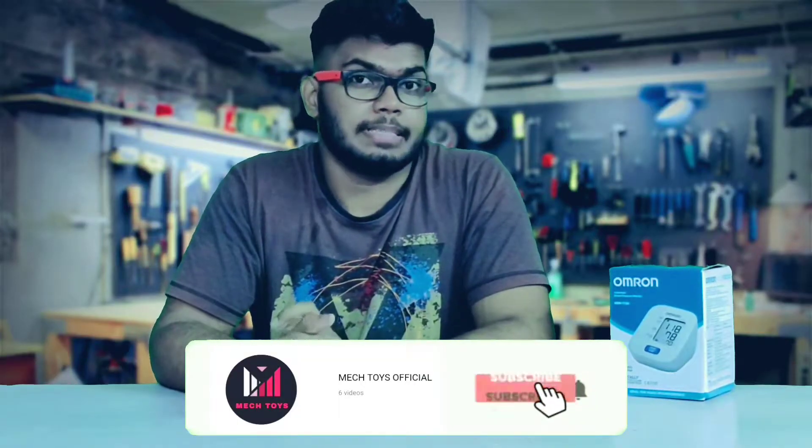Today we will unbox and review one of the best-seller blood pressure monitors on Amazon, the Omron HEM7120. Let's unbox it.